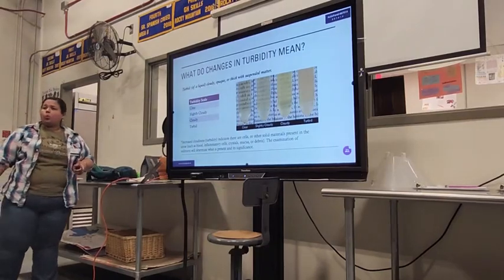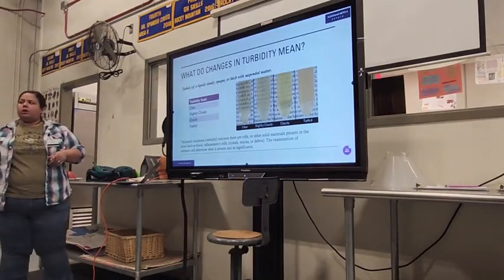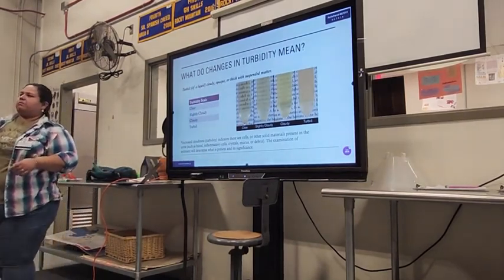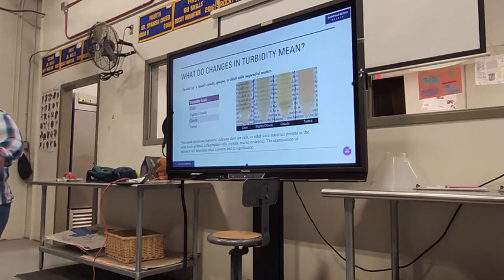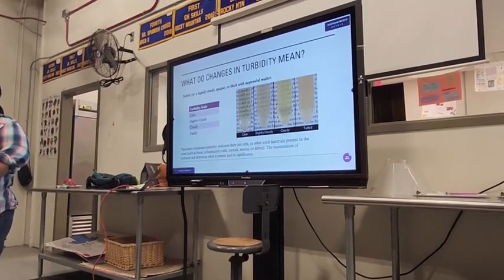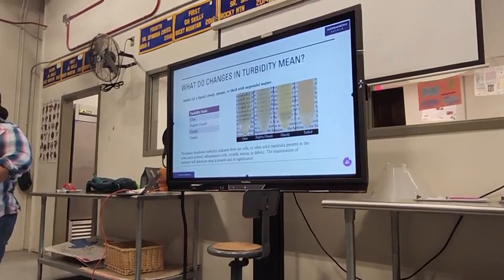No. Are you sure? Okay, so what does a change in color mean? Anybody give me a category? Yes. Okay, red means there can be some sort of internal bleeding. Anybody else?